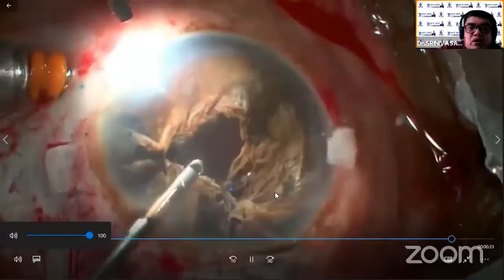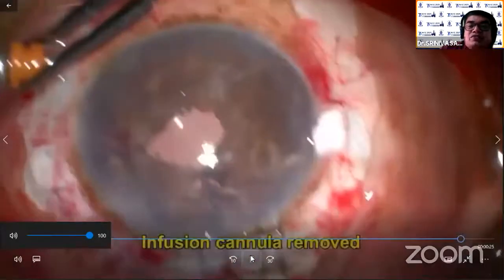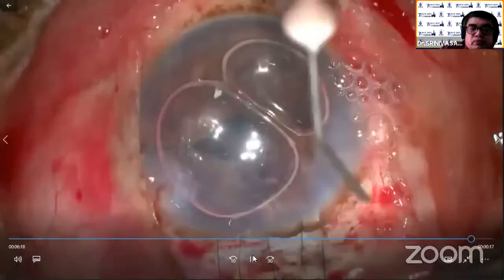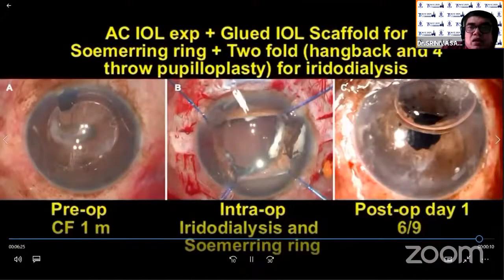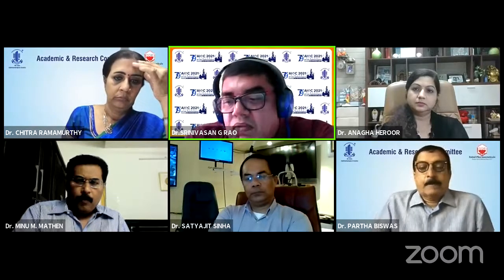The lens part is taken care of with the glued IOL. I normally use the endoilluminator for all these difficult procedures — I don't advocate this for regular cataract surgeons. Put an air bubble, close the wound, do all the gluing. I would like to thank the organizers. I mainly showed this for three points: if there is an iridodialysis less than 3 clock hours, use the iris hangback technique and repair it; if the pupil is not centered, use pinhole pupilloplasty to make it centered, which will also correct higher order aberrations and irregular corneal aberrations.